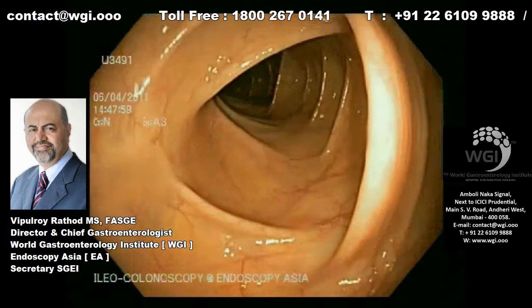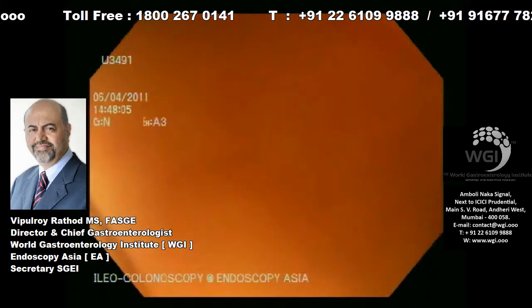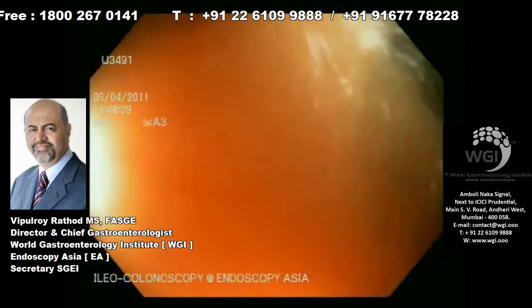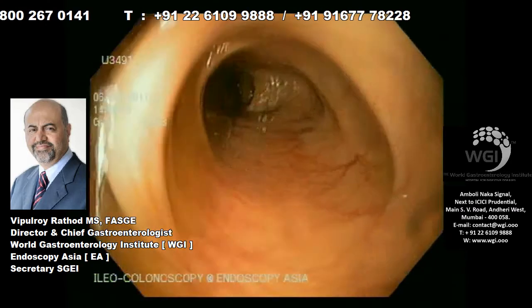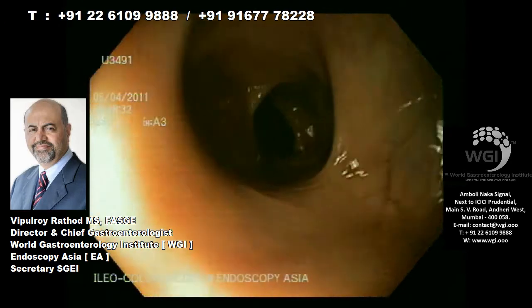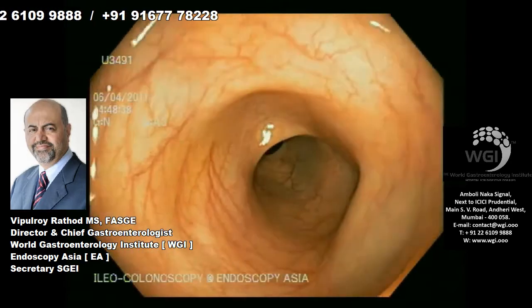This patient has a history of bleeding per rectum, and elsewhere there was a diagnosis of a polyp in the colon, somewhere in the rectosigmoid junction. But whenever we have cases of bleeding per rectum, it is mandatory to always go up to the terminal ileum and make sure that you do not miss any other bleeding lesion.